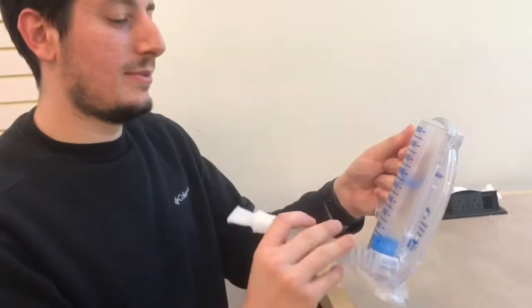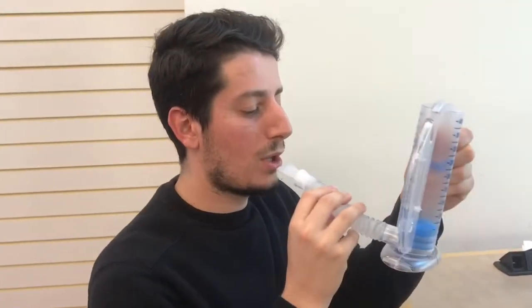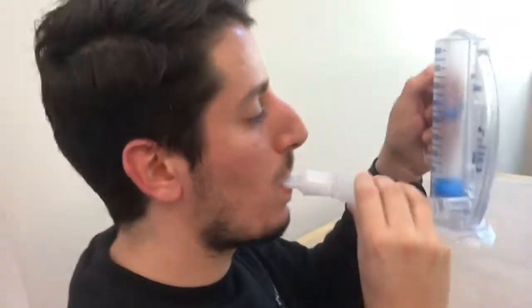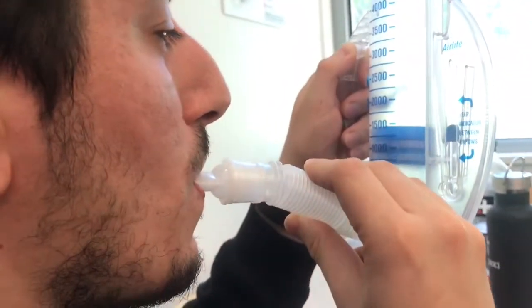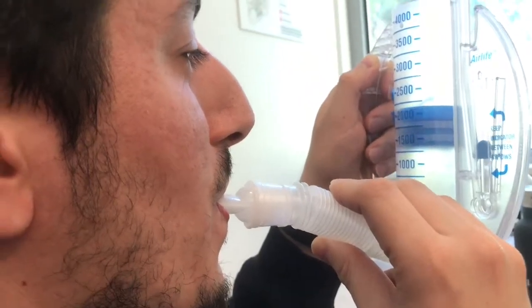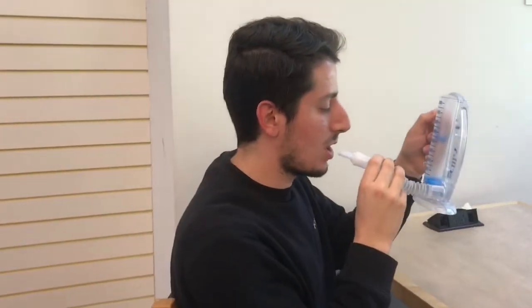Let's show you the proper way. You get your IS, you're going to breathe everything out, then put your lips around the mouthpiece and inhale as much as you can, keeping that indicator in between those little lines. Keep breathing in as much as you can until you can't anymore. Then cough up whatever phlegm.